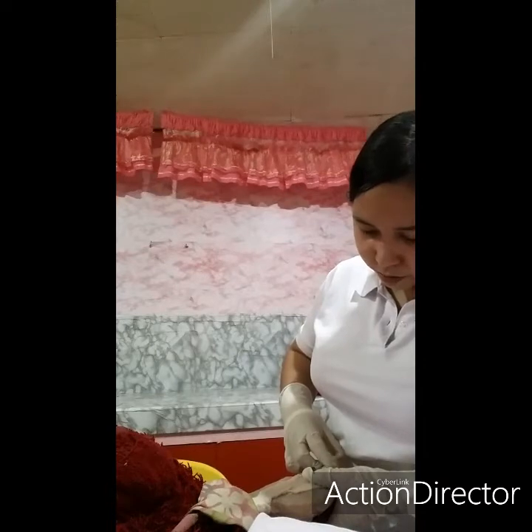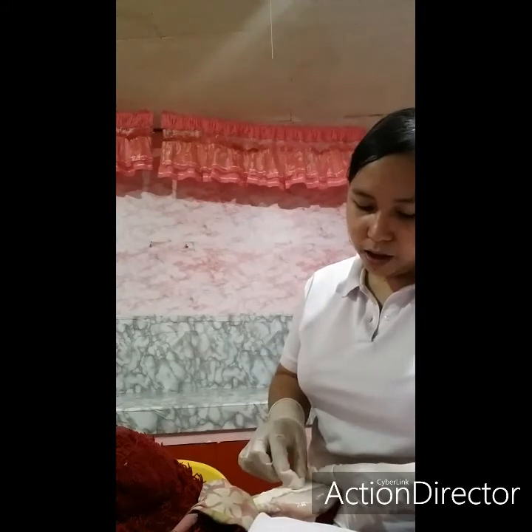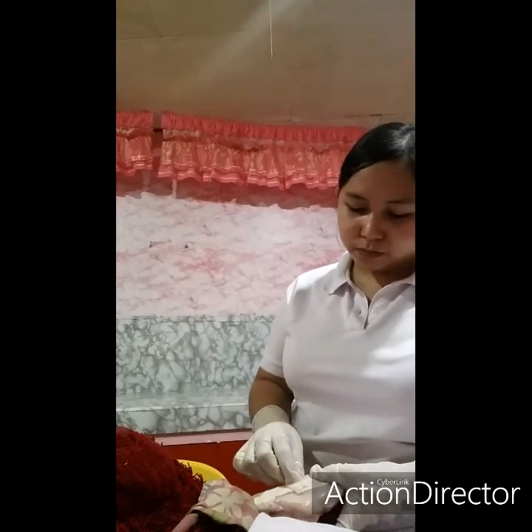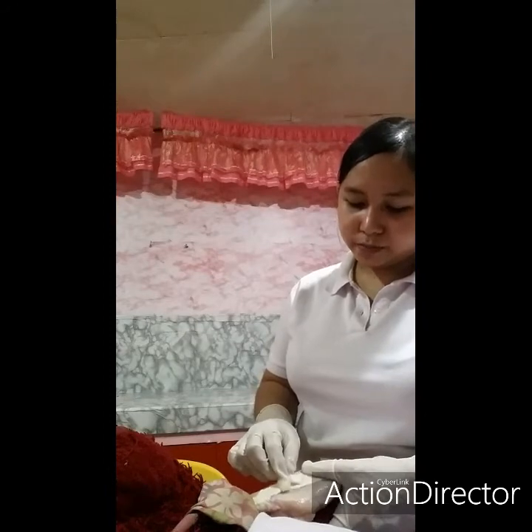Then aspirate. Then remove the needle and put a dry cotton, without massaging the area where we injected.